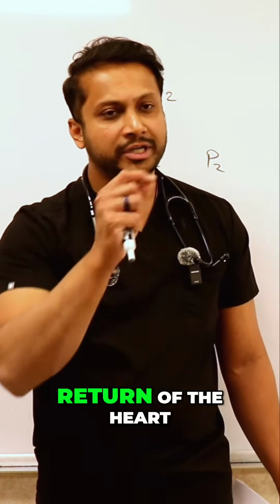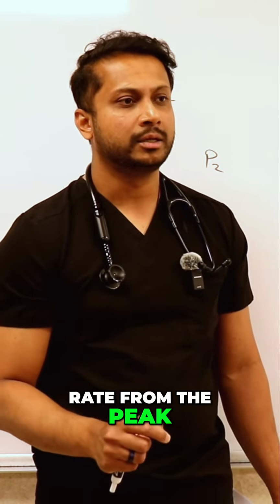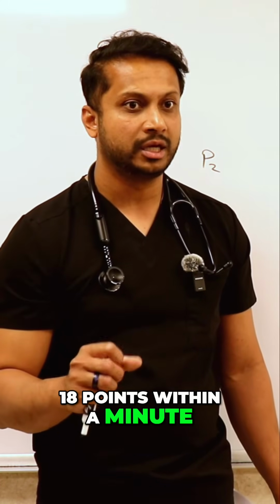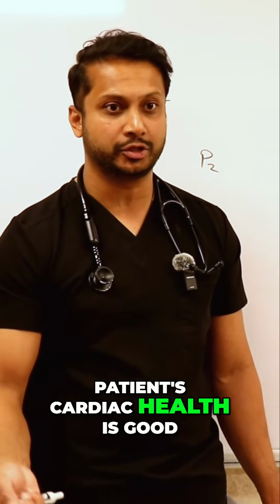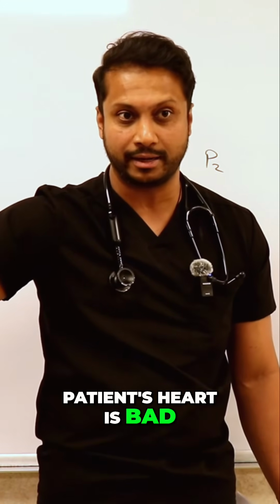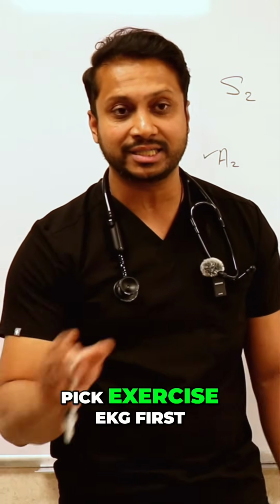Return of heart rate. Return of the heart rate from the peak. You should drop by at least 12 to 18 points within a minute. If it does, that tells you your patient's cardiac health is good. If your heart rate is still staying high, that tells you the patient's heart is bad. Okay? So always try to pick exercise EKG first.